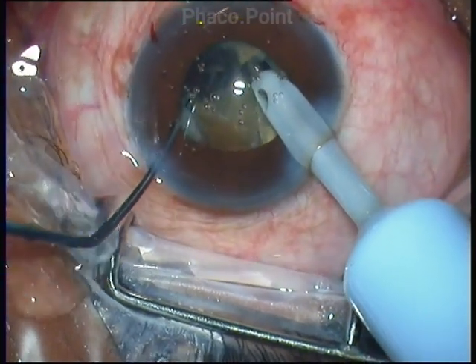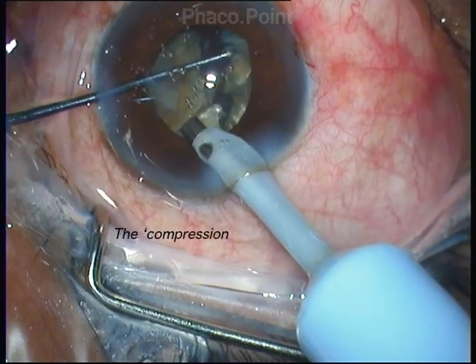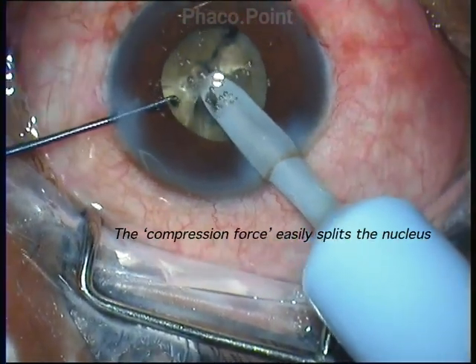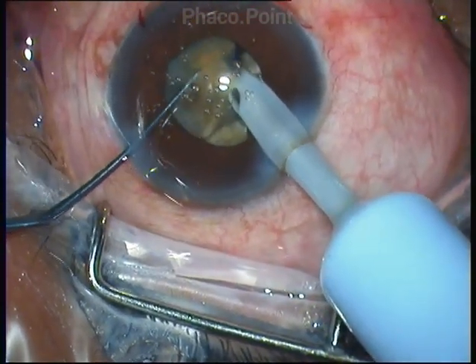When you go to the periphery of the nucleus or the equator of the nucleus and move it against the buried phaco tip, the force used is the compressive force and the amount of force required is considerably less.